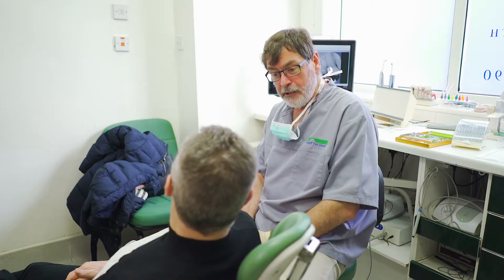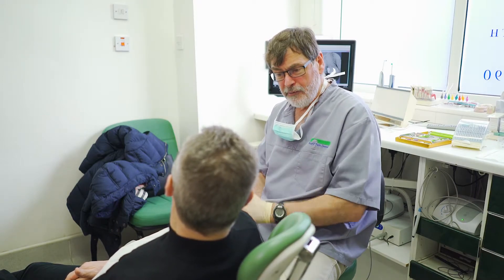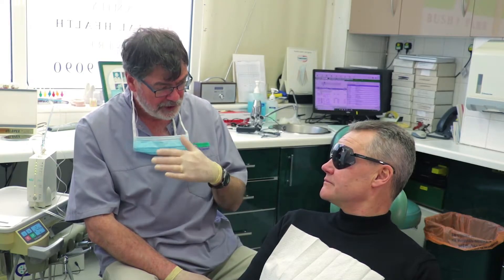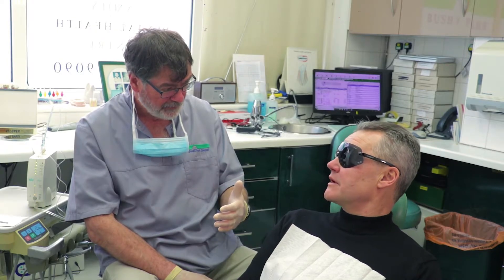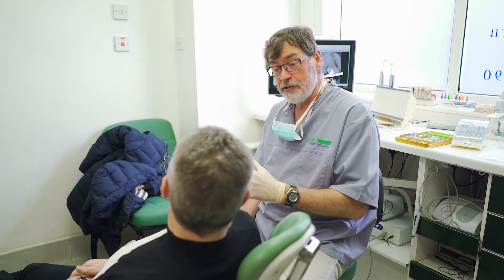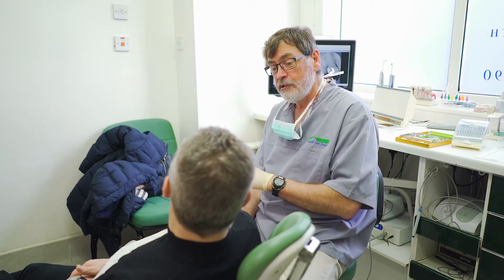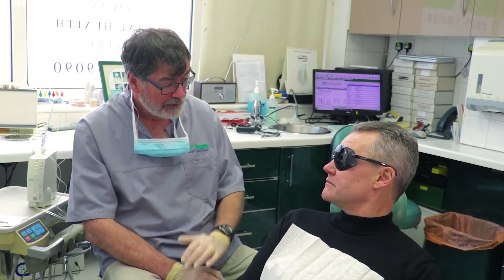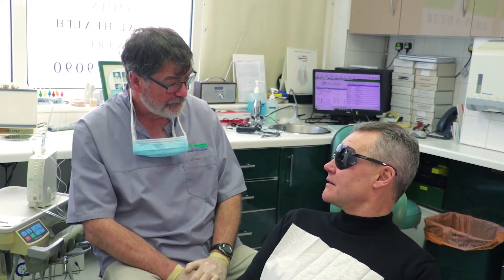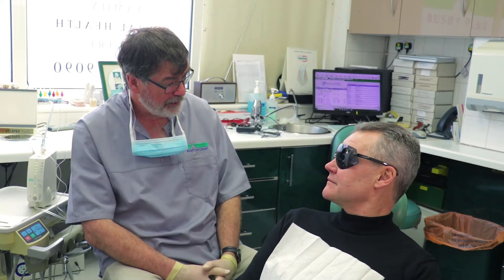Obviously to do that we're going to need to numb you up. I've taken some impressions for this, and it's now time to numb you so we can do all this work quite comfortably. We're going to numb you on both the cheek side of the tooth and the roof of the mouth side. People usually get a bit worried when I start talking about numbing them up, but the good news is we no longer use the big old syringes in this practice. We use the magic wand, which is a really nice way of delivering the anaesthetic very, very comfortably. Have you ever had that used before? Nope. I'll let you be the final judge of how this feels.